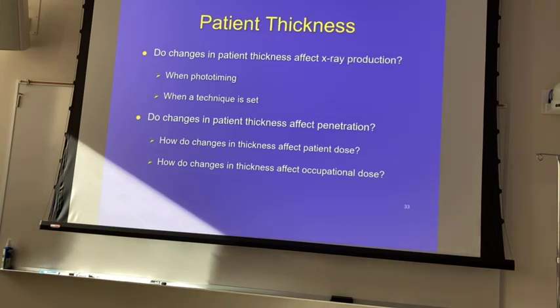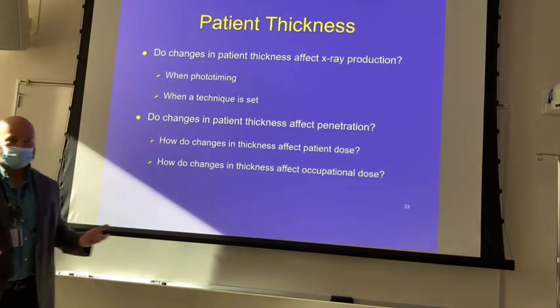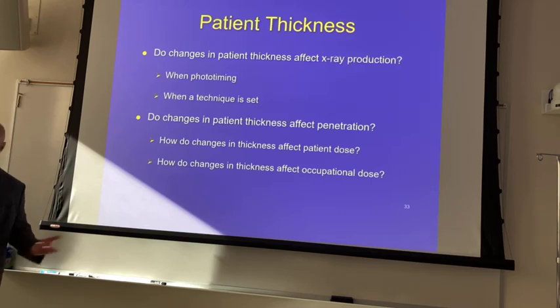Okay. So do changes in patient thickness affect X-ray production? And the answer is no. You shoot one patient with 10 mAs, 100 kVp, regardless of how big they are, it's the same thing coming out of the X-ray tube in both of those cases.